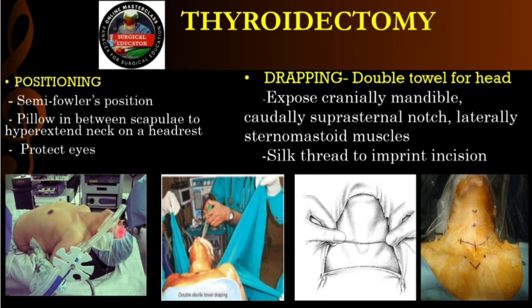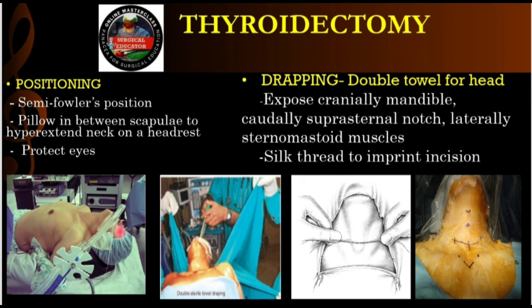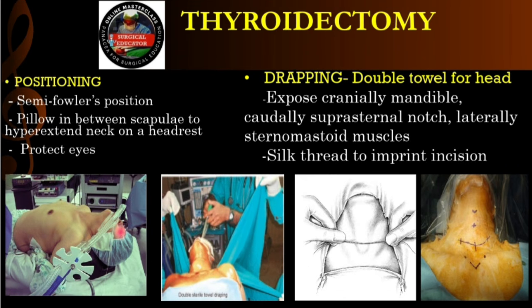Because normally the thyroid sits pretty low. Sometimes the lower poles are literally dipping down behind the sternum, hiding in the chest cavity. Totally out of reach. By heavily hyperextending the neck, you physically hoist the entire laryngotracheal complex and the thyroid with it up and out of the thoracic inlet. You project it anteriorly, right under the skin, maximizing the real estate between the jaw and the collarbones. You create a taut, wide-open canvas.